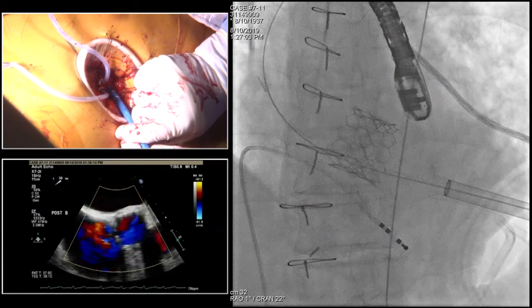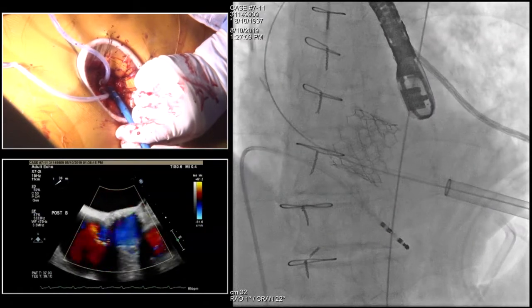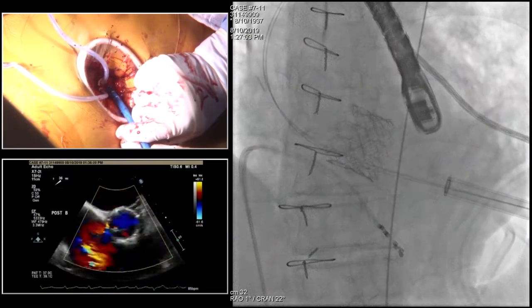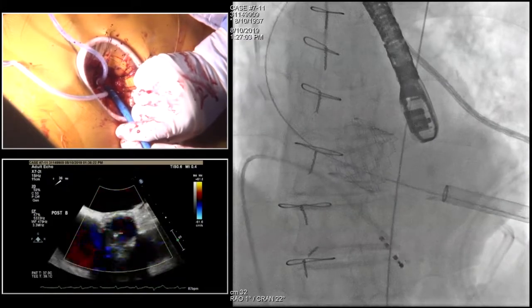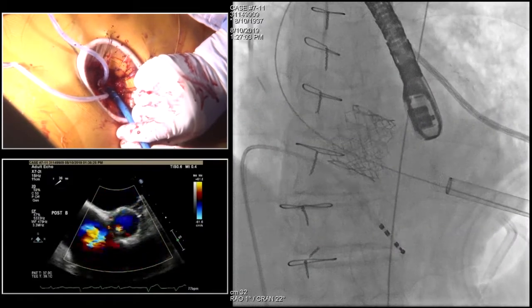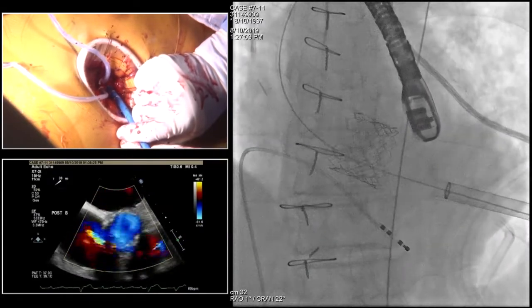Okay, we've heard it yesterday. You check the TE again? Yeah, the PVR much reduced. Much reduced? Yeah, okay, centrally are right now. Okay, got it. I agree. Okay, much reduced. Yeah. Okay, 자, 피그테일 테스트 살짝 해. Less than mild. Still a little there.